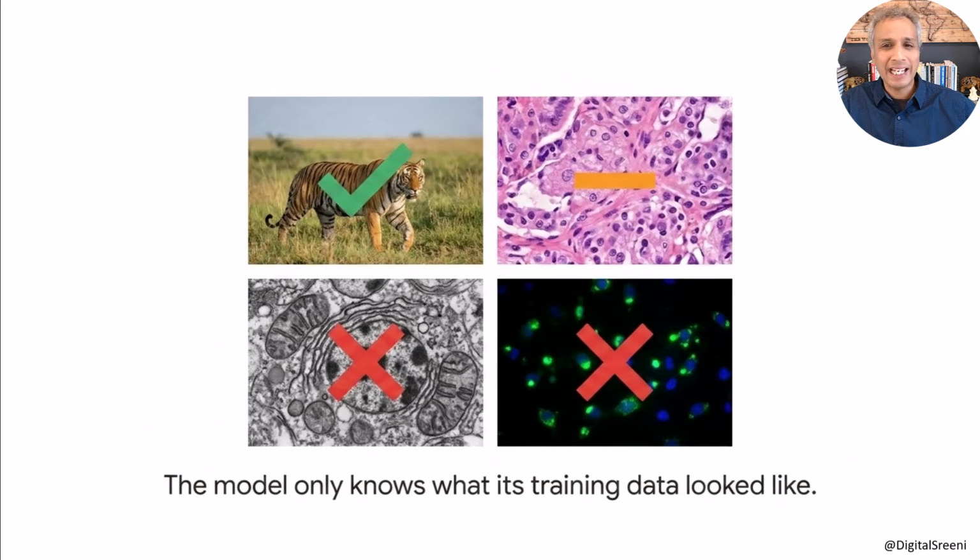And the model has likely seen some biomedical images in the training data via the figure captions, for example, in published data from papers and textbooks. So for clearly defined anatomical structures like glomerulus, it often works. It really works for these types of clearly defined structures. For fine cellular detail, it struggles. That's my learning from here.